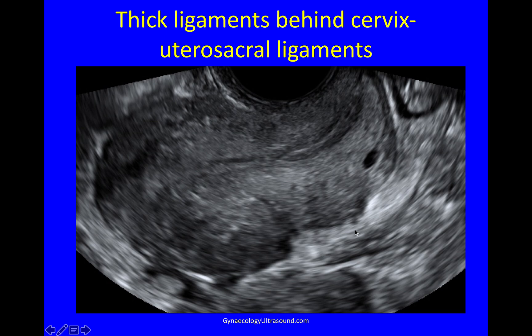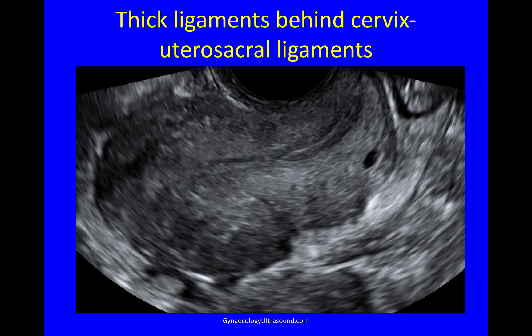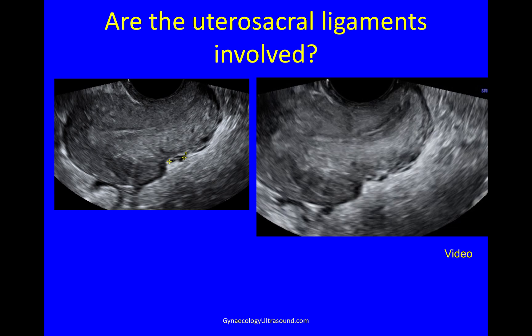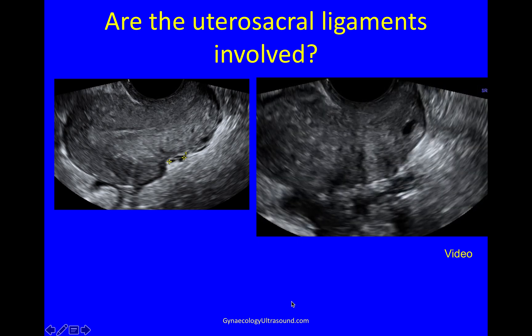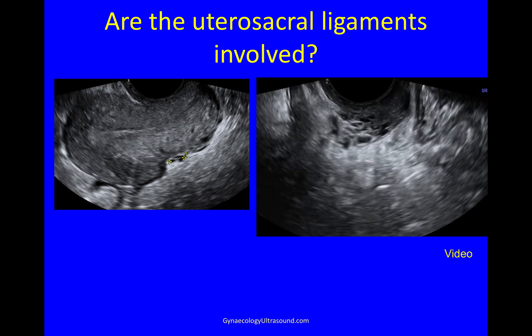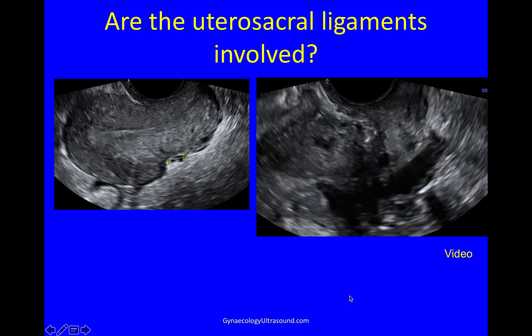You can see here that the ligaments behind the cervix are very, very thick and white. So there's the torus and thick white ligaments. Now I need to look in that area in more detail to see if I can find any deep endometriosis. Looking again at that area, I can see that there is a tiny little bit of darkness there — that's some deep endometriosis — and if I now scan side to side in the longitudinal plane I can see some more endometriosis just there.